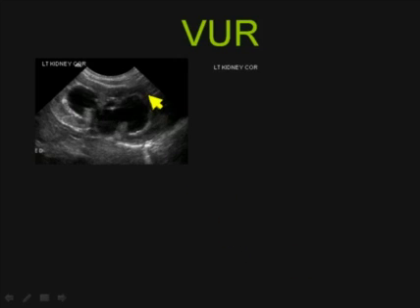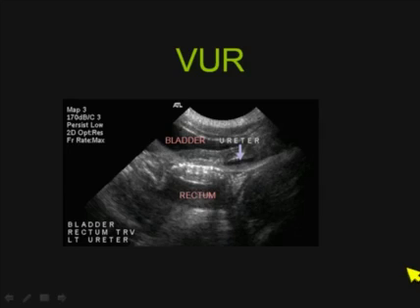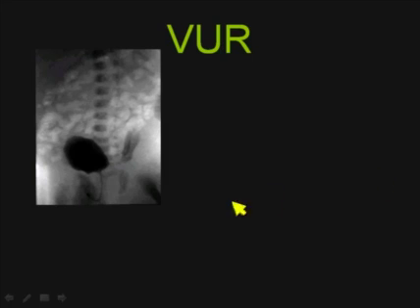In this particular child, there was marked dilatation of the pelvocalyceal system. There was preservation of the corticomedullary differentiation. The ureter could be traced, and in fact, we could see a lot of to and fro peristalsis, and coming down toward the bladder, we could see the distal ureter.